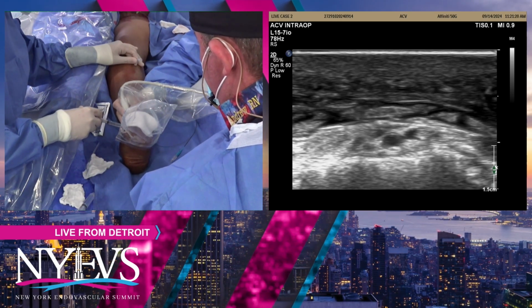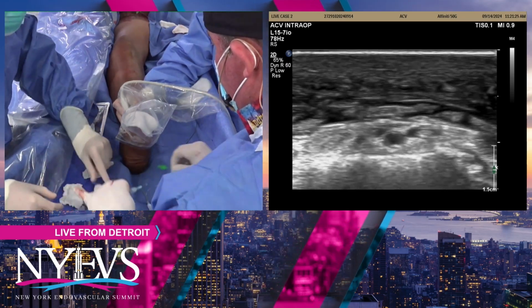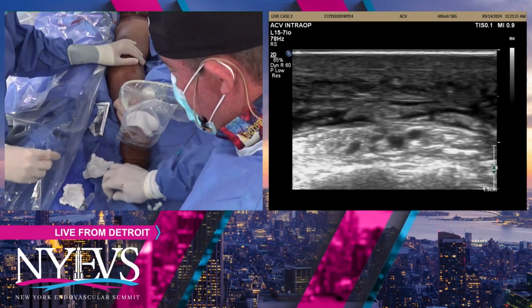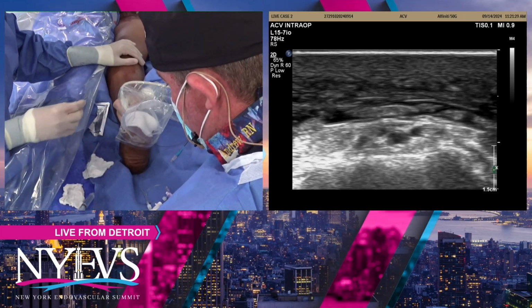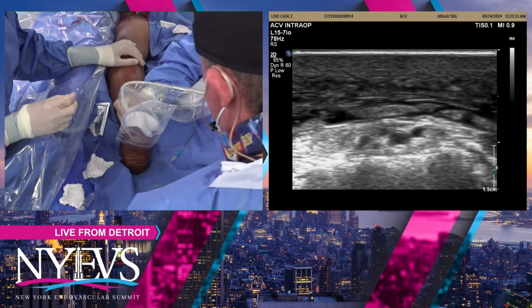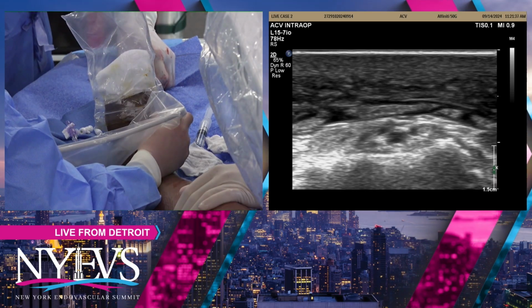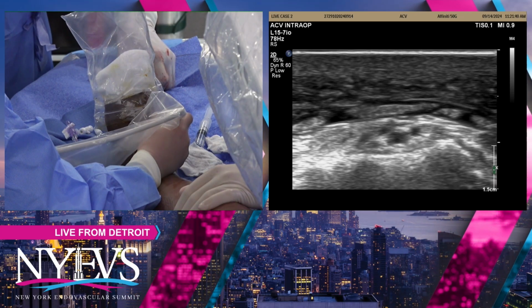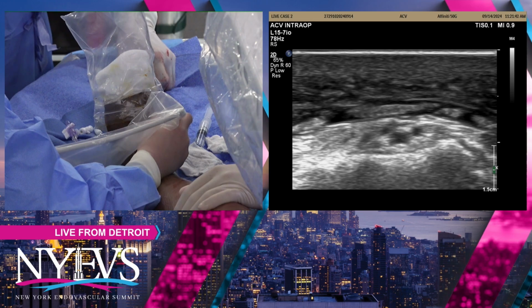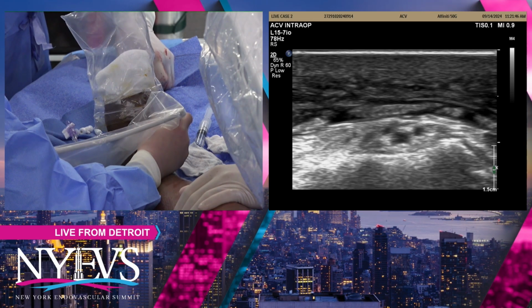Fadi, you have some high-priced help in the sense that you have a vascular technologist in the room with you. Many people don't have that. Can you talk through how to incorporate ultrasound guidance in your procedures, both in terms of access? I think most interventionalists can do the ultrasound for access themselves, but how about PAT studies and that sort of thing? Is that something you think we can do as interventionalists without having the extra technologists in the room?